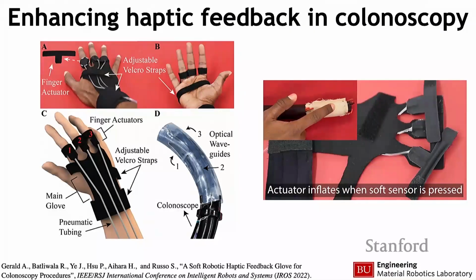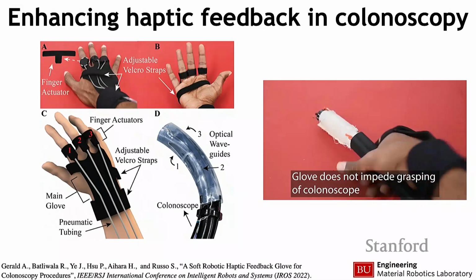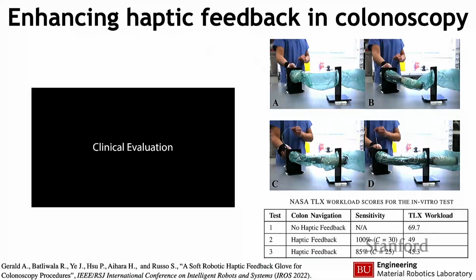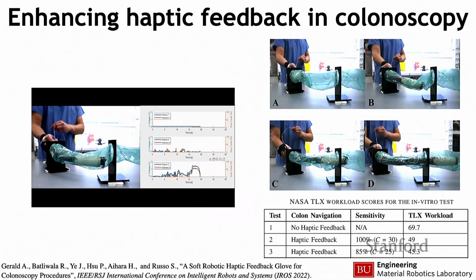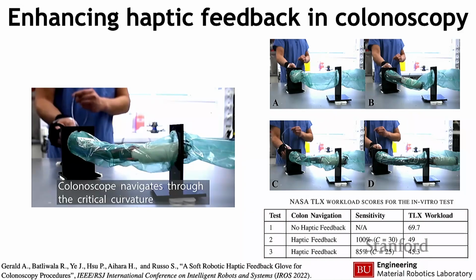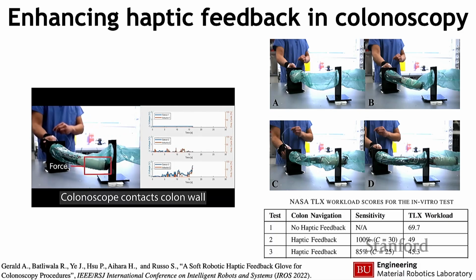And then we took this a step further by amplifying that haptic feedback back to the surgeon. This is the soft robotic sleeve that we have over here, and as we're pressing on it, we are returning that haptic sensation back to the surgeon as they are wearing a soft robotic glove over here. We were able to test this together with a surgeon collaborating with us at Brigham and Women's Hospital. This person especially is an expert surgeon. We are hoping to start testing on novice people as well. But the goal is really providing that level of extra awareness for the clinician such that they can perform better procedures.